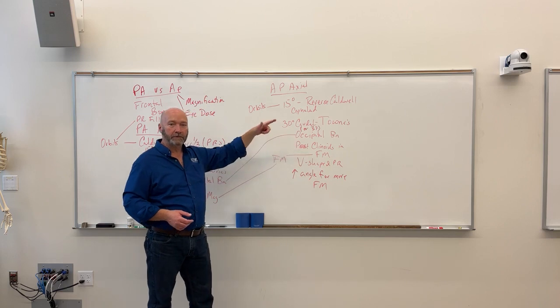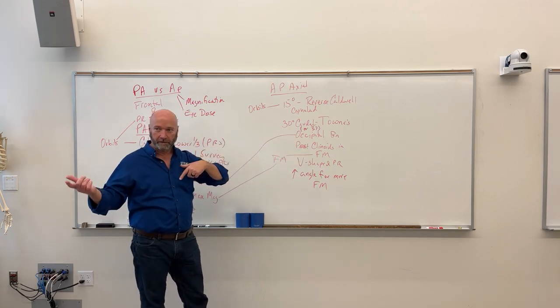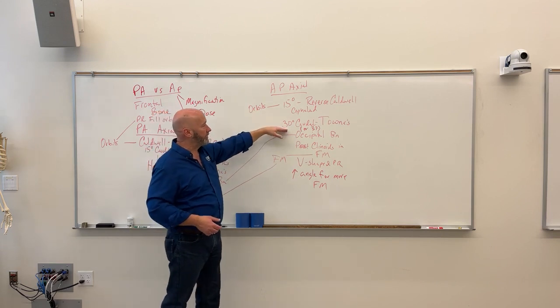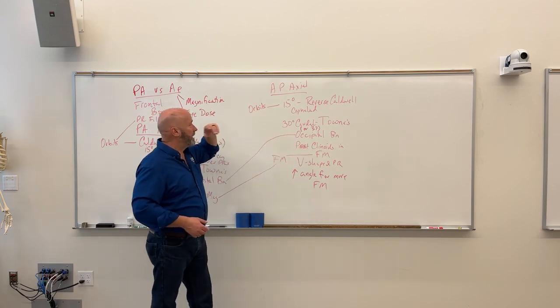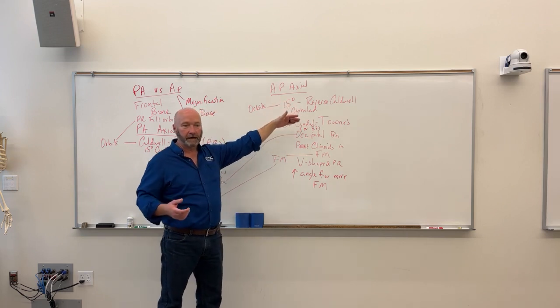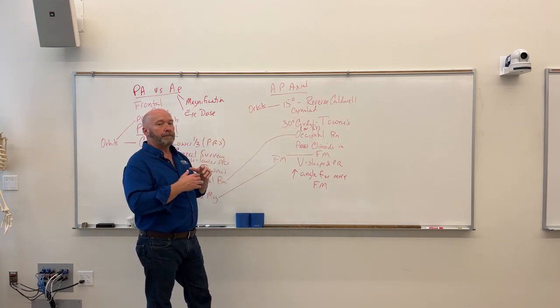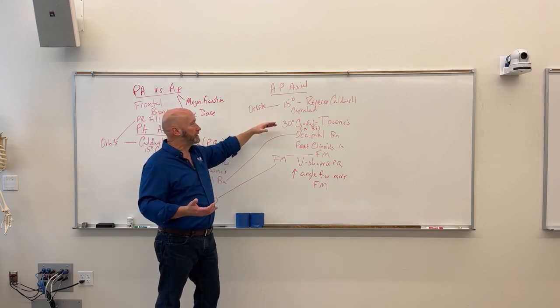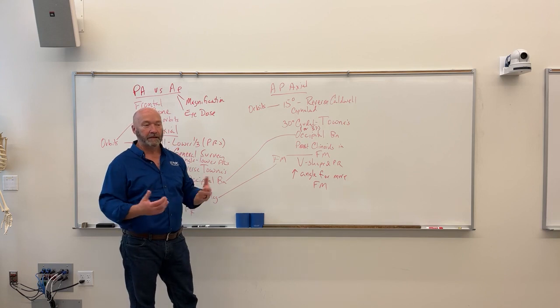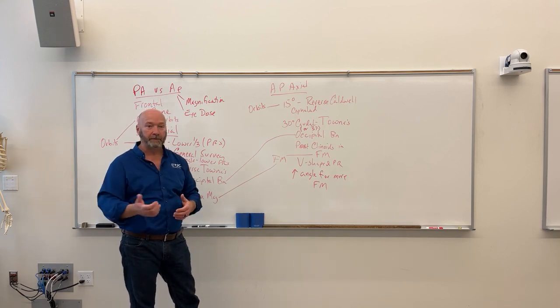So Towns, you angle down, like go downtown, right? Down for the Towns. So you angle caudad, 30 degrees caudad for the Towns, as opposed to the reverse of the Caldwell, we're going to angle 15 degrees cephalic, right? So any Caldwell is going to have that 15 degrees. If it doesn't have 15 degrees, it's not a Caldwell by the textbook.